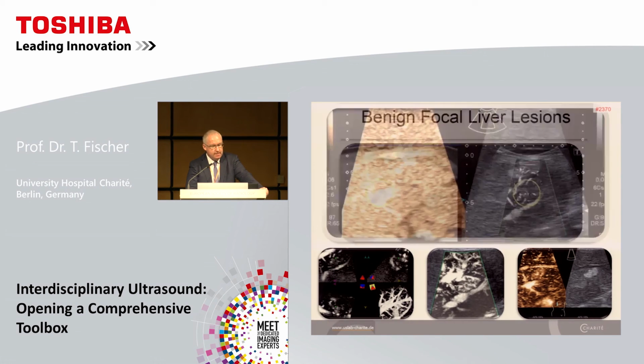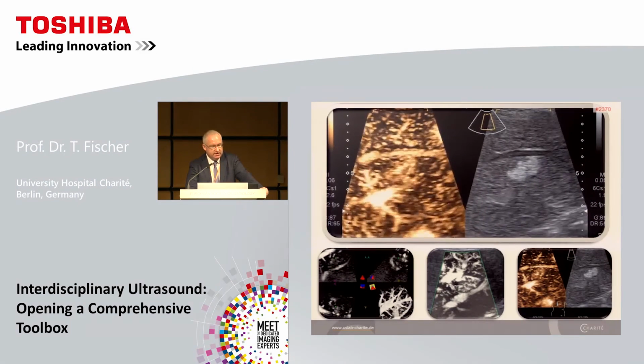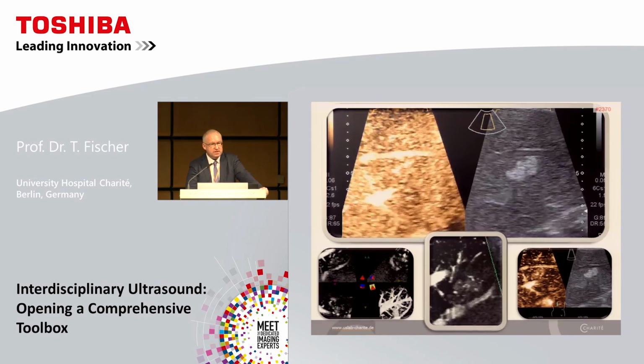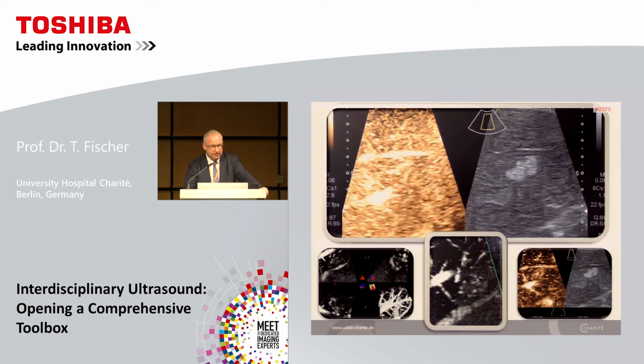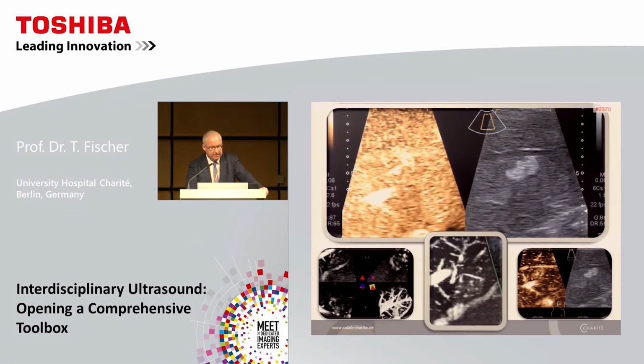The same case, having a contrast study available. And we do first flash to see the inflow, and then we double check with SMI in the late phase after 4 minutes after the bolus administration. And I can demonstrate we see the same things. So that's really important for the understanding.